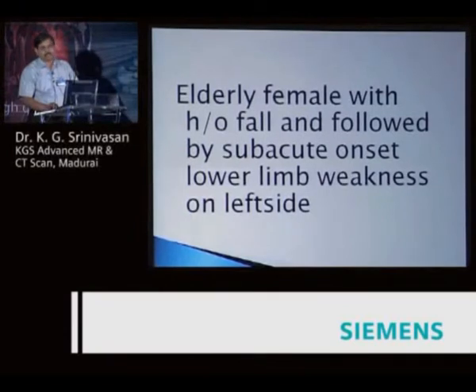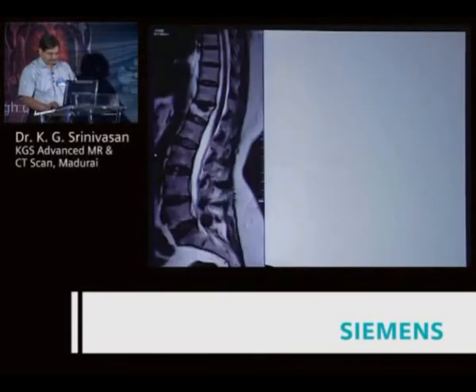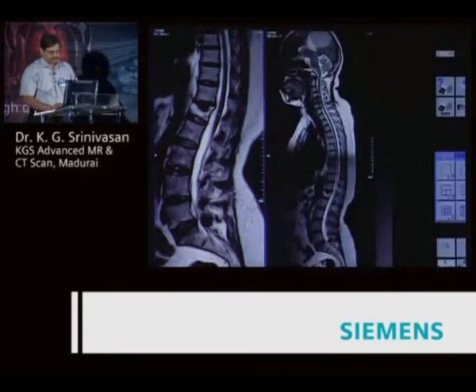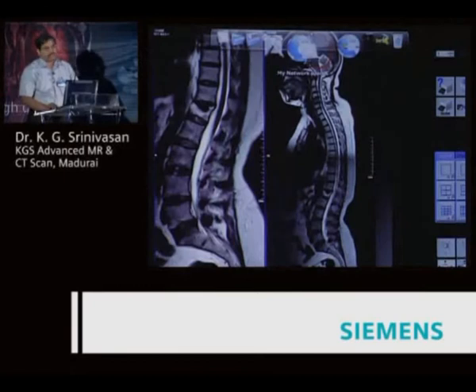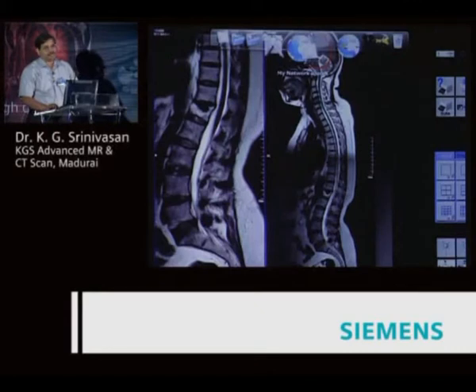Elderly female with history of fall, followed by subacute onset lower limb weakness on the left side. First MRI showing a compression fracture at D12 — but we should not stop there. You can see there is a large parasagittal meningioma, responsible for the left side lower limb weakness. That is very crucial.